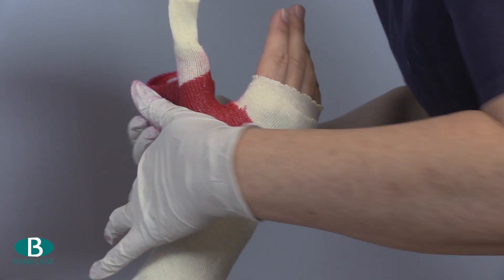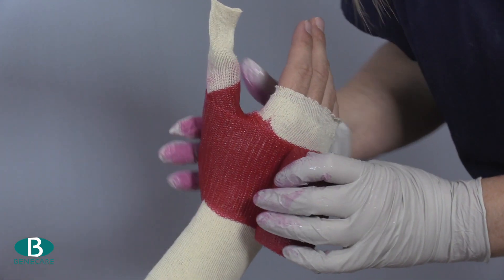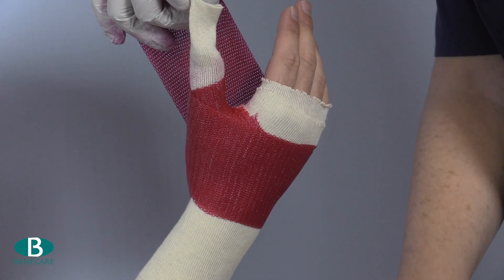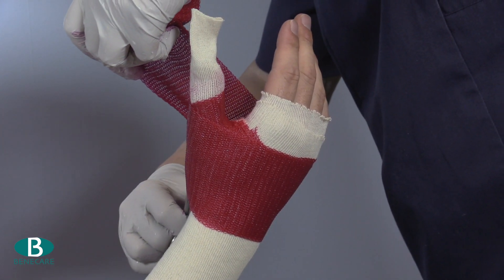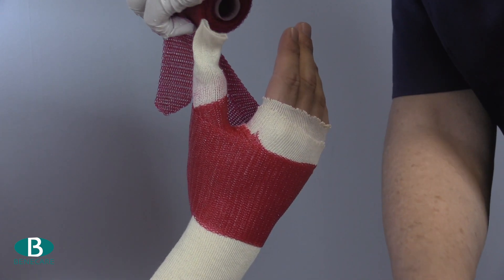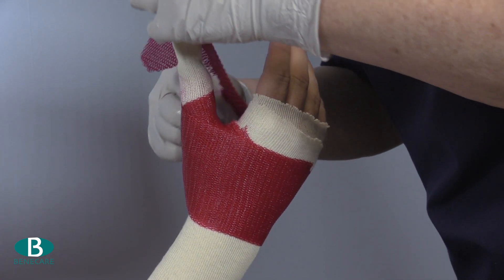Position the edge of the slab on the palmar aspect of the hand with the cut in the web space. Then continue it around the thumb across the dorsal aspect and around onto the palm. Now cut the casting material from the base of the thenar eminence diagonally across to the web space, leaving approximately 1cm to fit through the web space. This will ensure a custom fit.